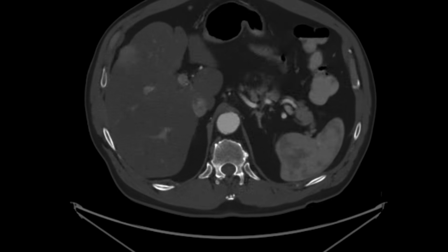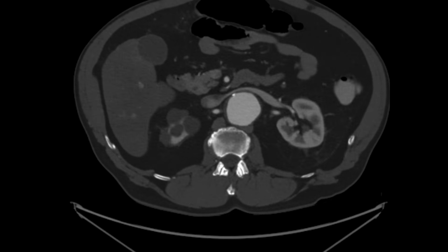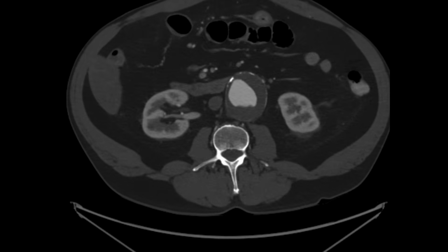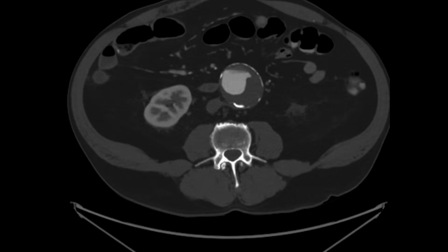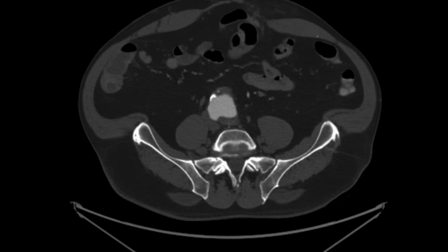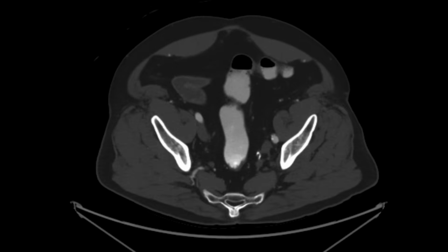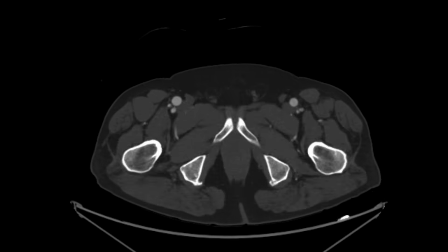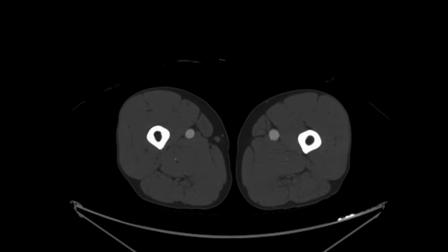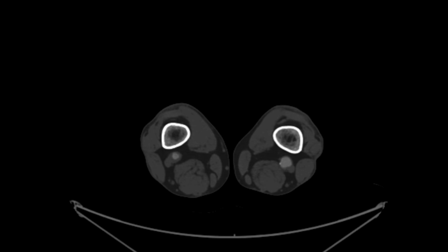This is a 5.9 centimeter juxtarenal AAA with a single mesenteric vessel as a common origin of the celiac and SMA. His renal arteries are patent bilaterally and his IMA appears occluded at the origin and reconstitutes distally. He has ectasia of the bilateral common iliac arteries and an occluded left hypogastric artery. He has ectasia of the bilateral common and superficial femoral arteries, as well as bilateral popliteal artery aneurysms, which measured less than 2 centimeters bilaterally.